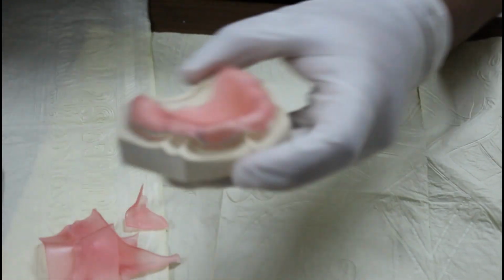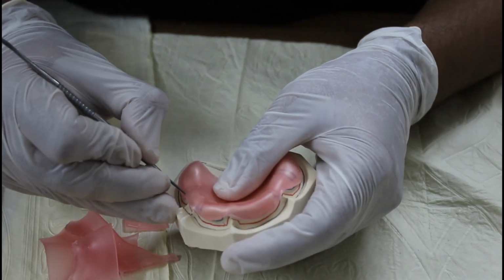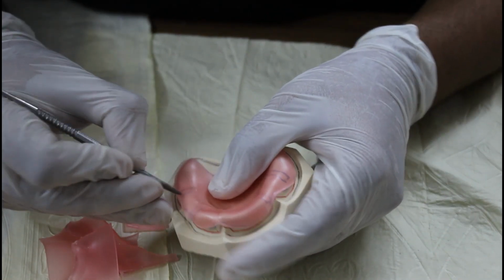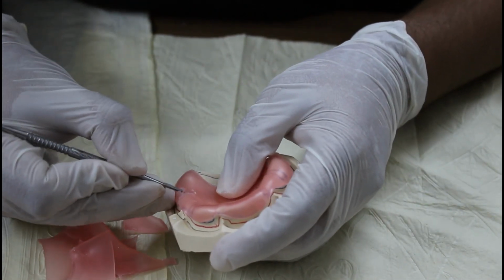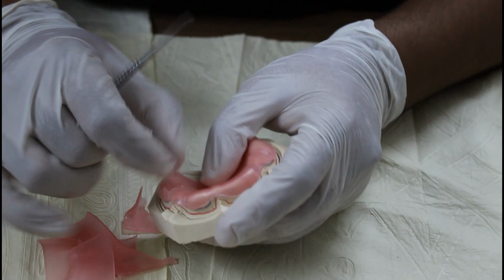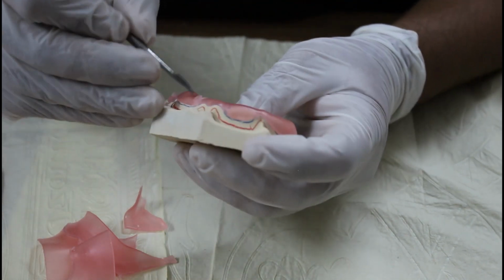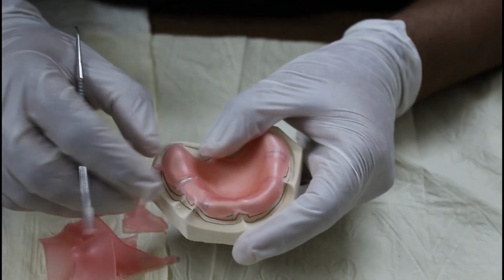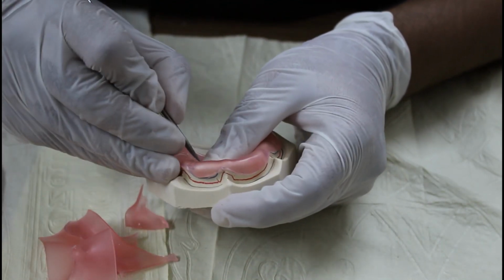We have cut it. Now cut the space for the tissue stops. This is how your tissue stop will be cut. Cut all 4 tissue stops.